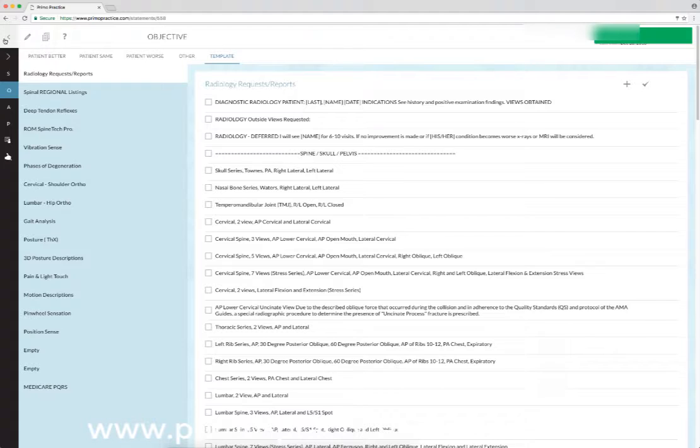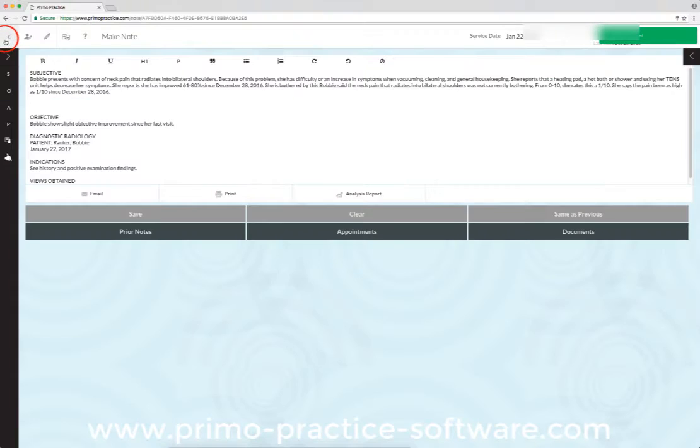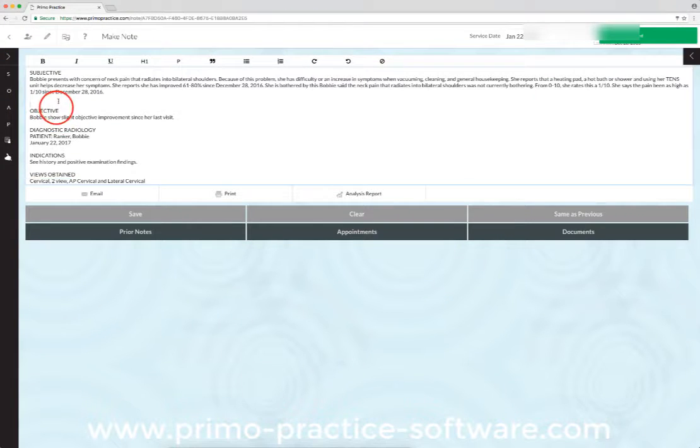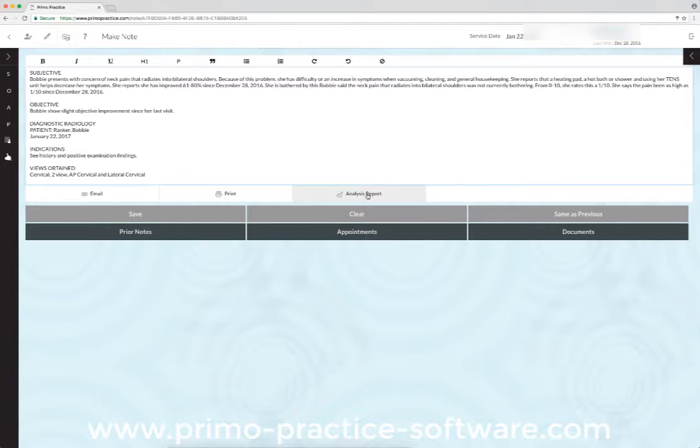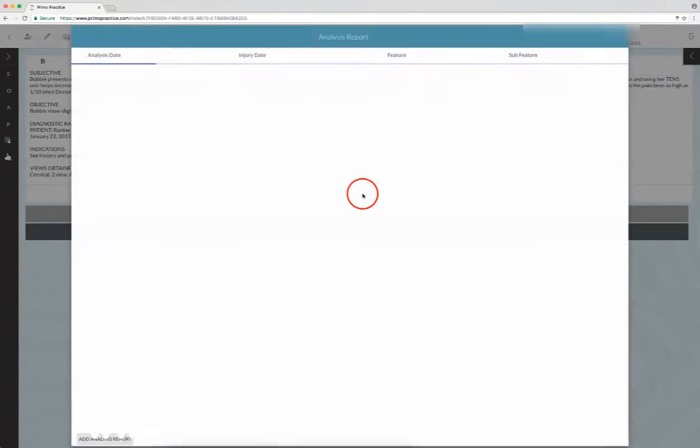Now I want to insert—it's going to put all the information about that study right here into the note, but I want to insert the report itself, a picture of the analysis. So we'll click analysis report.